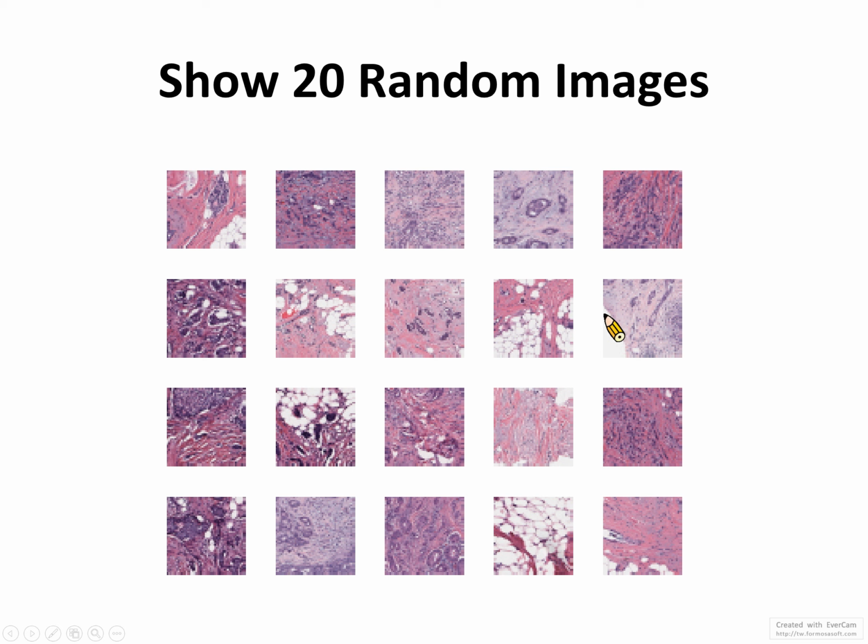And you can see these patches are all from different parts of the whole slide scanning, and it's actually very difficult to extract certain features based on this small part of the data.